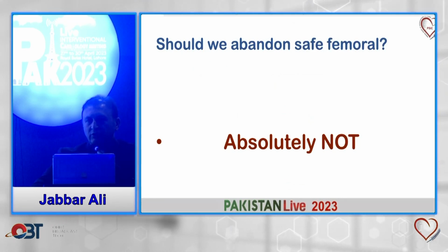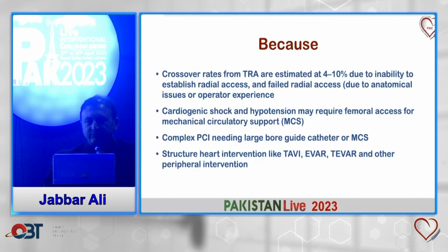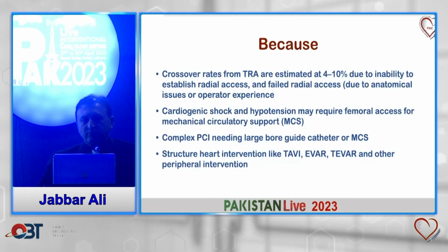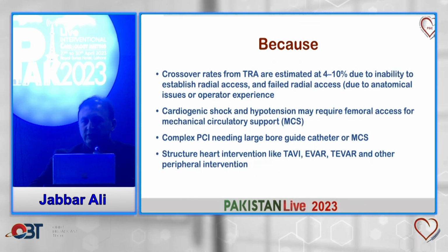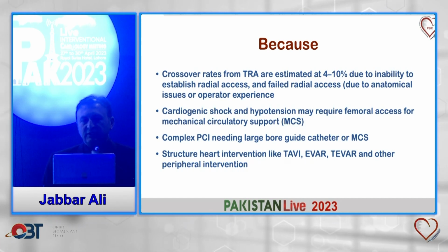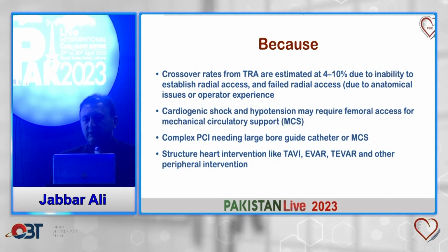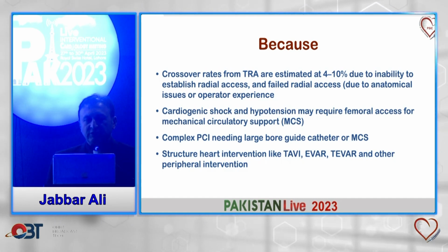Should we abandon safe femoral? I think absolutely not. This is apolitical, absolutely not. The reason, because crossover rates from transradial is estimated 4 to 10% due to inability to either access the radial artery or failed radial access due to anatomical issue or tortuosity, etc. Operator experience.